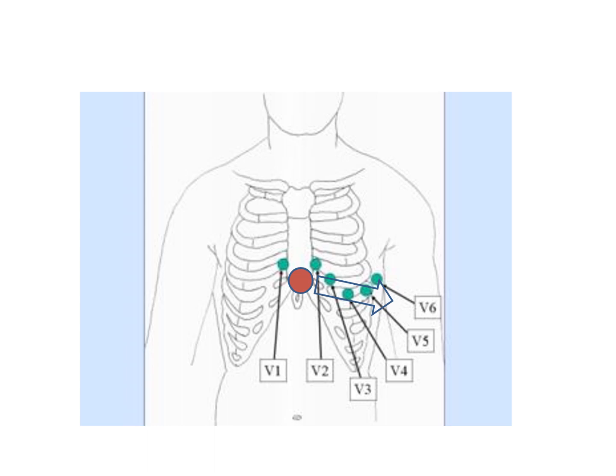This is where the precordial leads come in. They were designed to tell us where electricity is going in 3 dimensions, or rather in the 3rd dimension. And how they work is you take the electrical center of the heart, which is the AV node, and then you draw a line from that imaginary point to where the lead is on the surface of the chest.